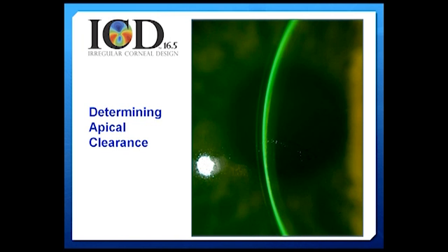We could also use the thickness of the cornea to determine the thickness of the posterior fluid, although with patients with corneal thinning disorders and thinner corneal tissue, it may not be the best reference point.